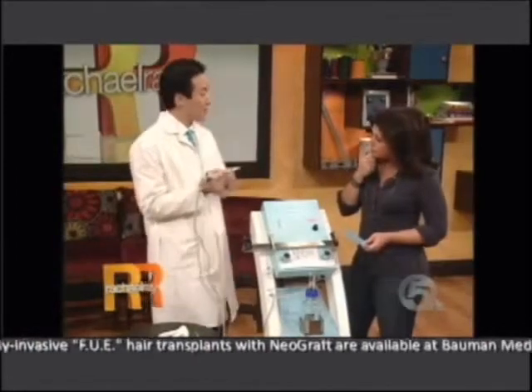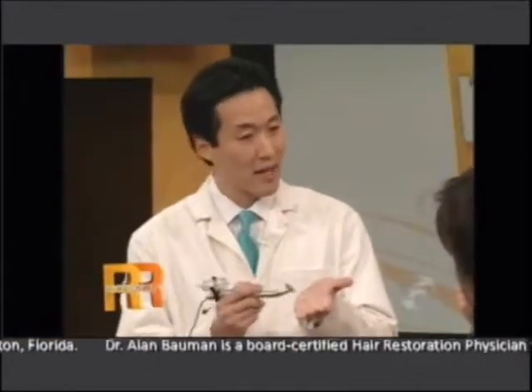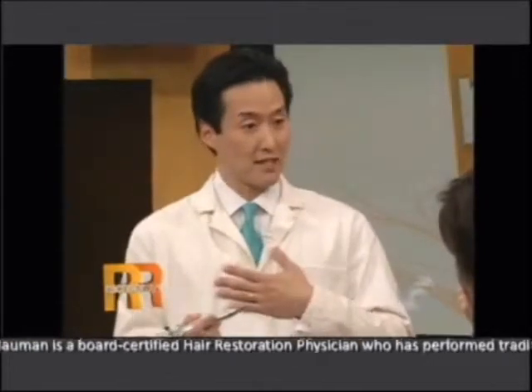Okay. Now, the other benefit of this is in the past, we can really only take hair from one part of our body, just the back of our head, because you'd end up with a large scar. With this, because we're punching it out, hair by hair, you can technically take hair from your chest and put it on top of your head. You can take hair from your back, and even theoretically, you could even take it from your armpit and put it on top of your head if you really wanted to. Really? You had to put that in my head? And it's theoretical. Take that back.